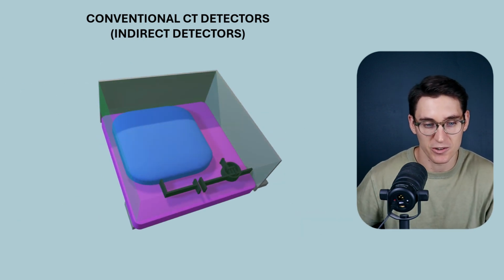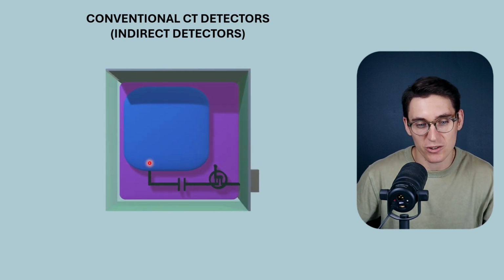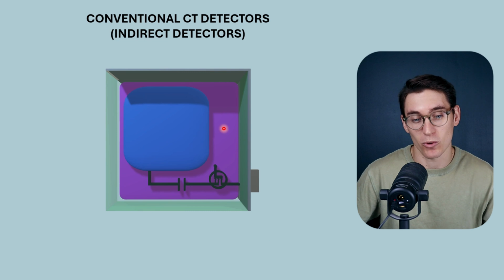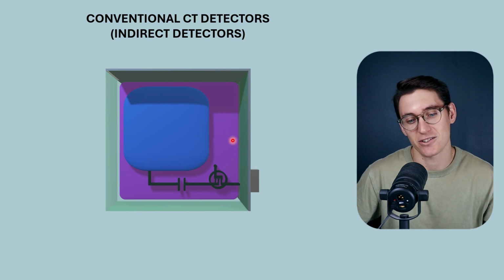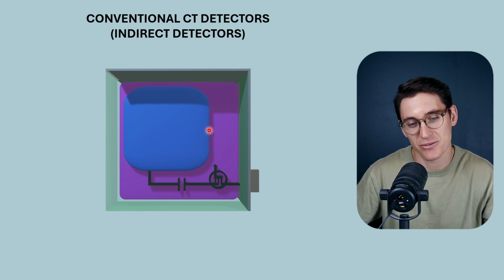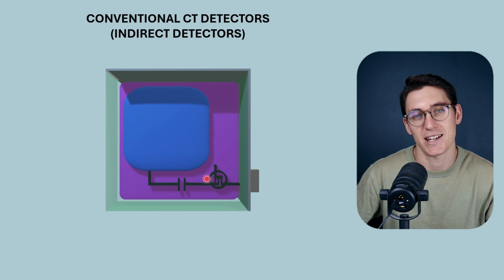So let's look at this head on. We can see the photodiode layer here. Only this blue region on the photodiode is sensitive to light. The rest of the components here, if light photons are incident on them, are not going to contribute to our final signal. That's what's known as the fill factor, the difference between the area that we're actually sensitive to light versus the total area of the detector.